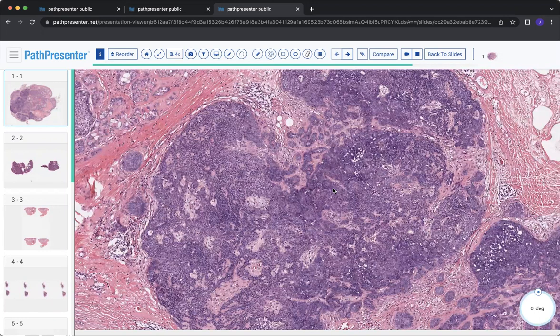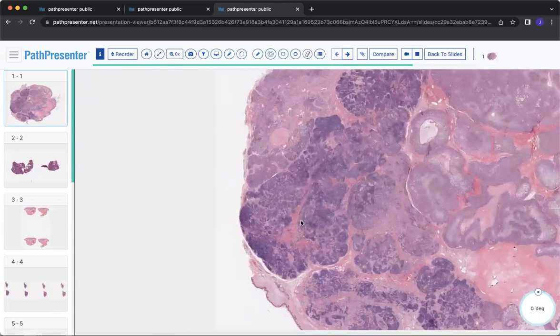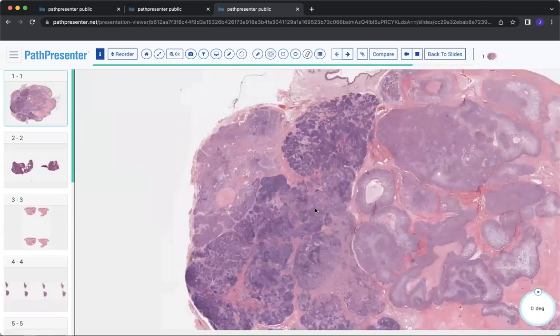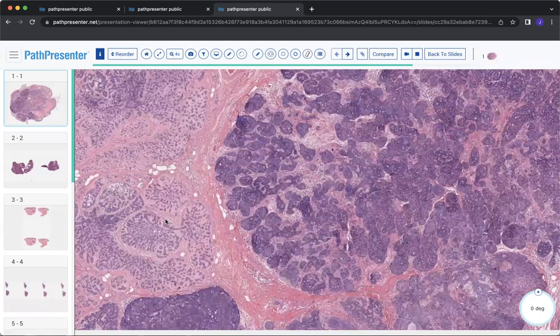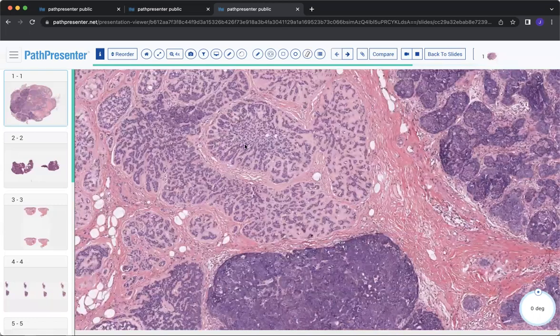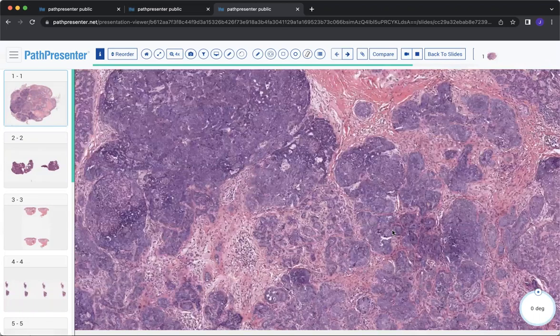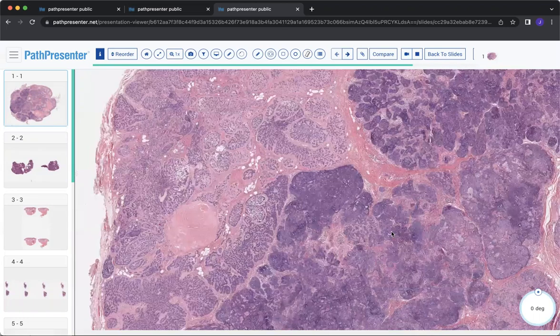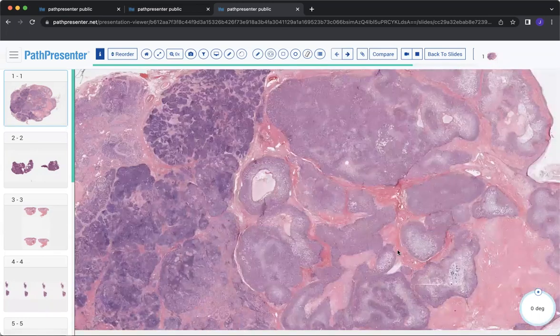You can see when I say basaloid, what I refer to are these very hematoxylinophilic islands. So it takes up a lot of the hematoxylin. And it also is taking on this well-defined, almost palisading look to it. And it kind of looks like a basal cell in some areas, just at moderate power here. So when you hear the term basaloid, you can think of that island of more purple cells.